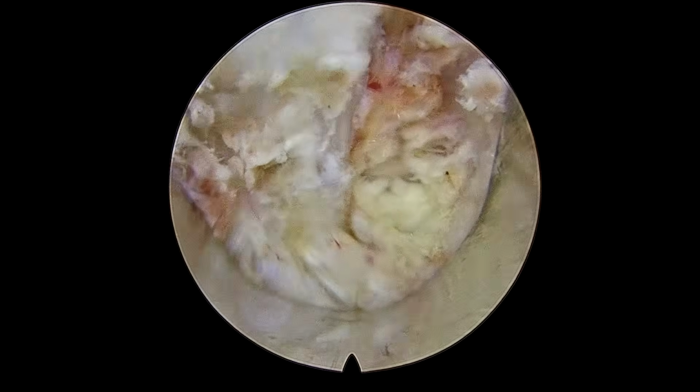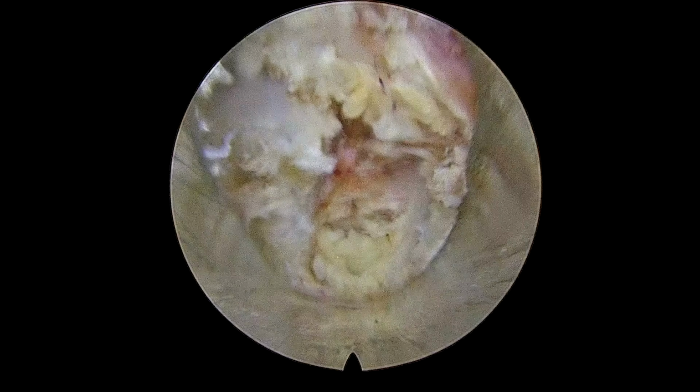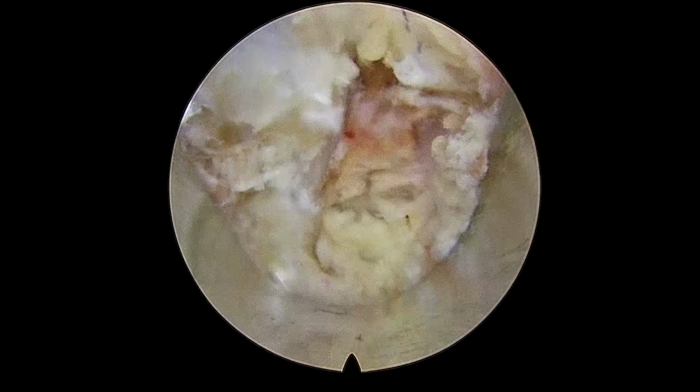So you can see here, I'm trying to coagulate every bleeder the moment I see that bleeder. So whether it is a small bleeder or a large bleeder, try to coagulate it the moment you see it, because in the cervical spine they bleed like hell, and certainly it will hamper your vision.